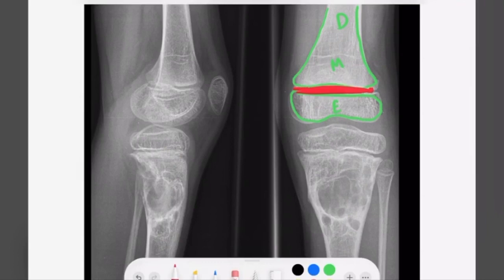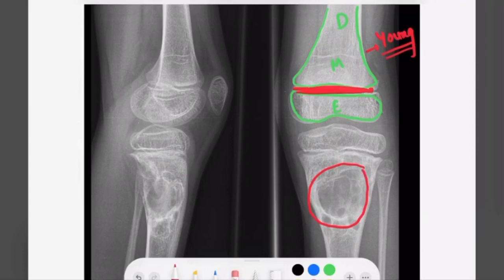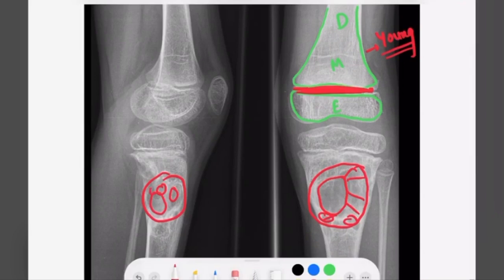This region of physis means this bone has not matured — this is the bone of a young age group. There is a lesion which is showing multi-loculation, which is a soap bubble appearance. The physis is also visible and not matured.